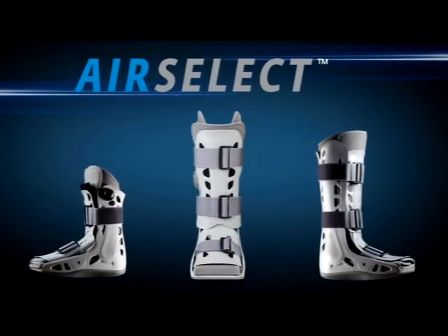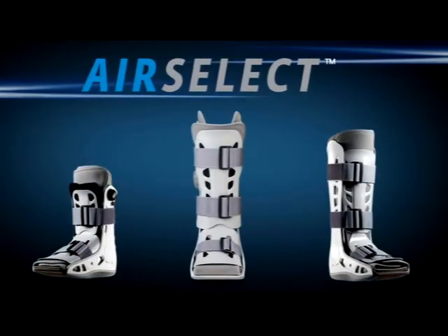The AirCast AirSelect Elite. The ultimate combination. Designed for comfort. Engineered for healing.